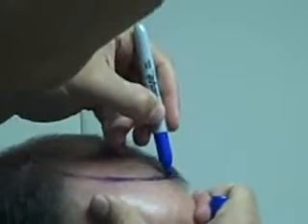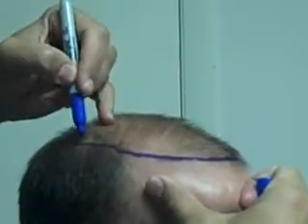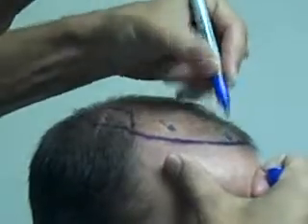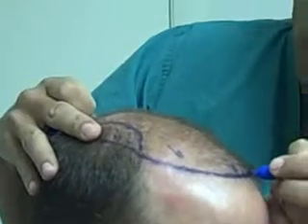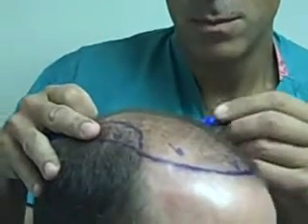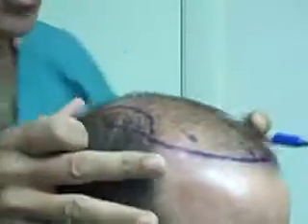Now, we have the ability to do a little bit of lowering, as you desire it. On this area on the side, these hairs grow sort of like this, so I make this separate. These hairs are going to grow like that. These hairs are going to grow like that. Same thing on this side. Once again, these go down like that, then these are more like this. So I follow that natural transition.